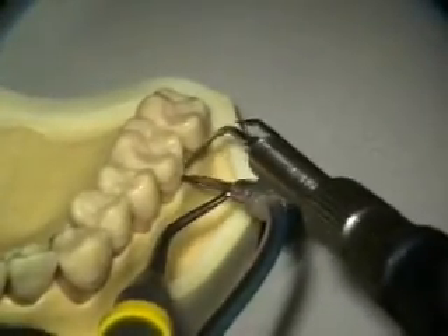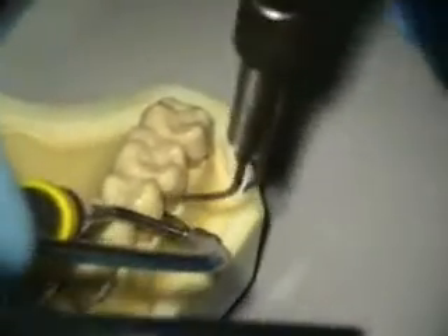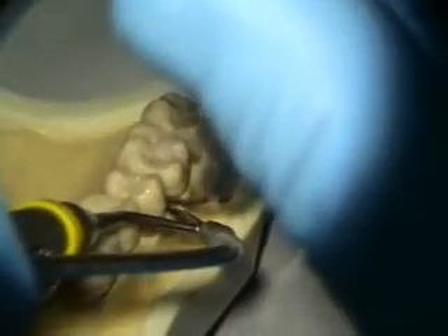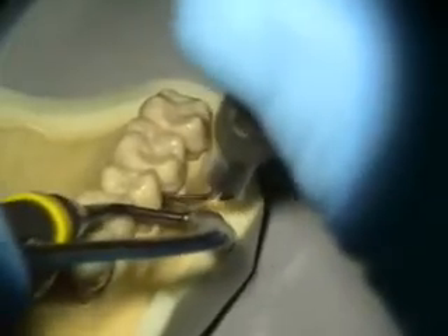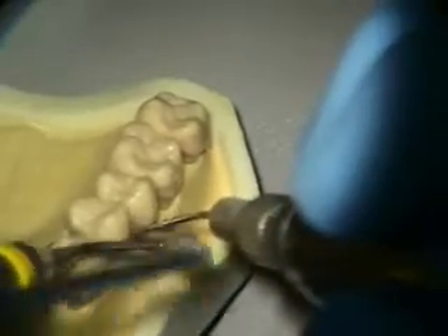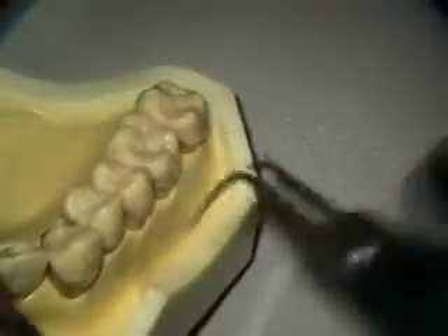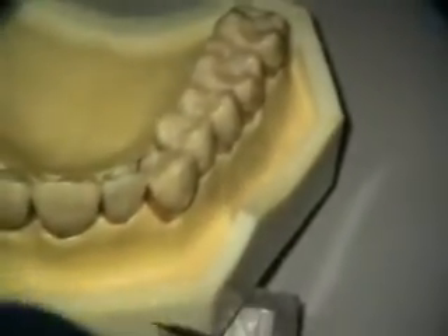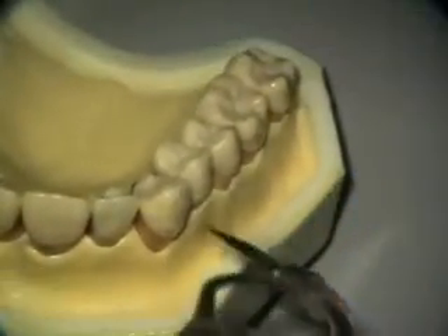Distal buccal, furcation area around the corner here, angling up a little bit. Looking at the screen, moving around and cleaning. Sometimes you have to twist the camera to really get in there, or sometimes you might want to cross-instrument. I don't do that very often though. I get near the front here and a lot of times I can just tilt the patient a little more.